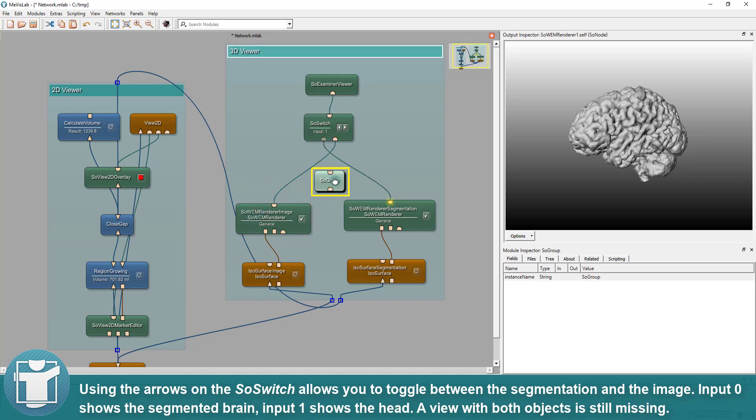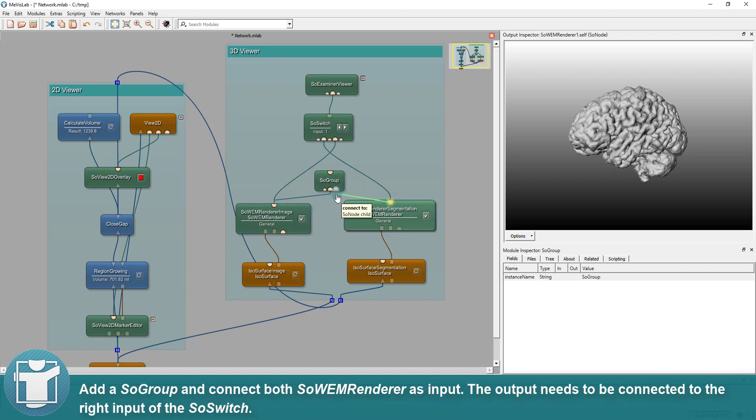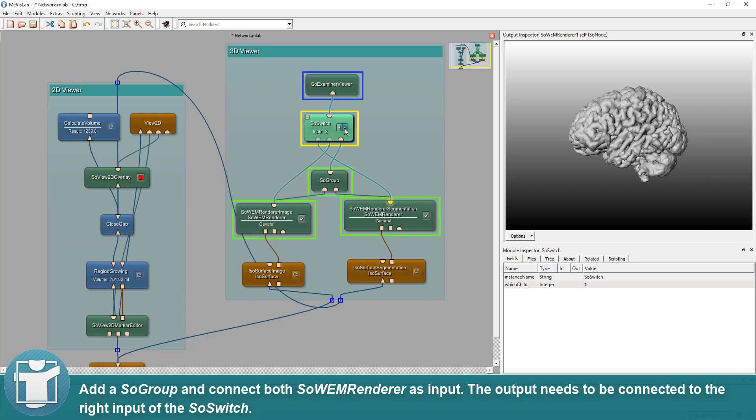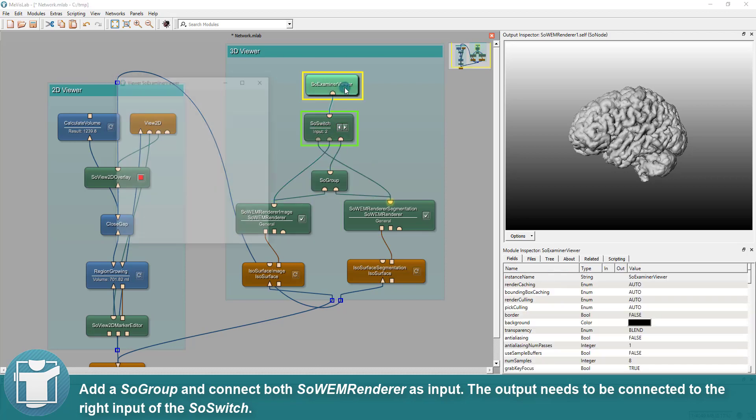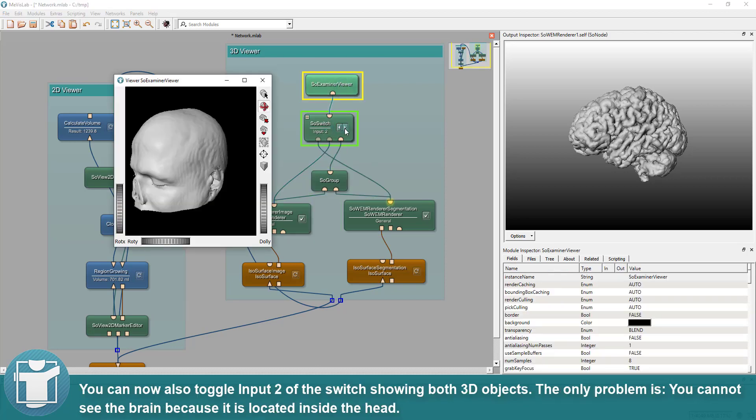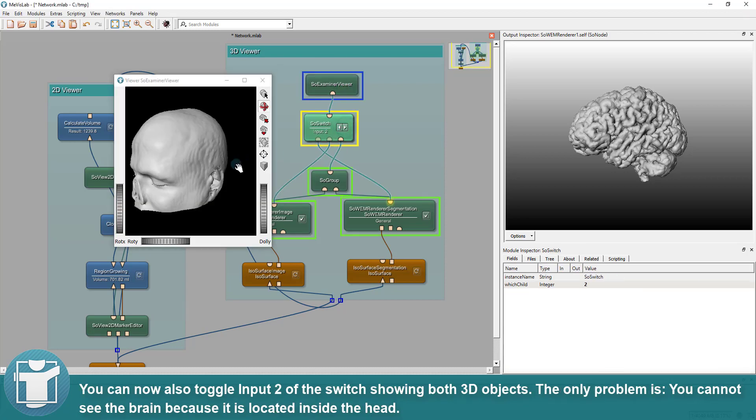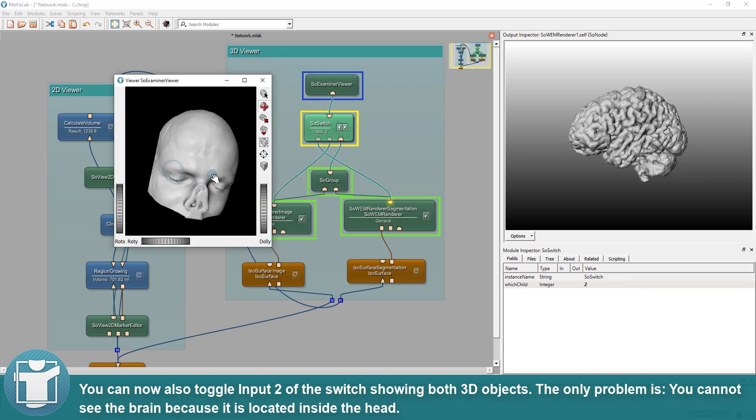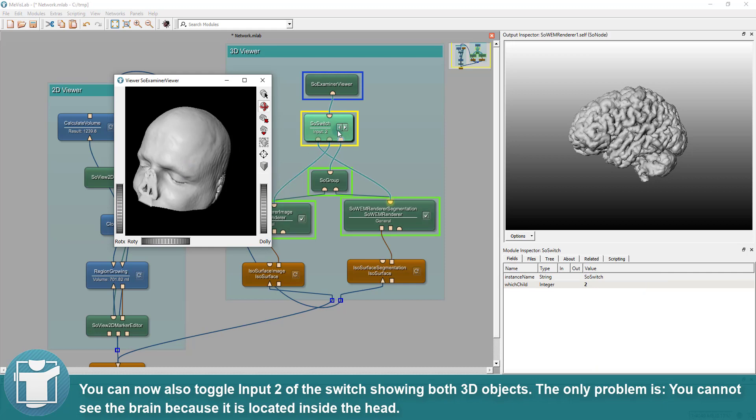A view with both objects is still missing. Add a SoGroup and connect both SoWEM renderers as input. The output needs to be connected to the right input of the SoSwitch. You can now also toggle input 2 of the switch showing both 3D objects.